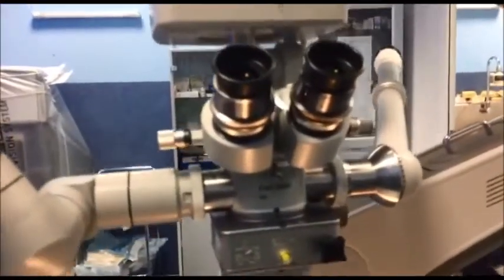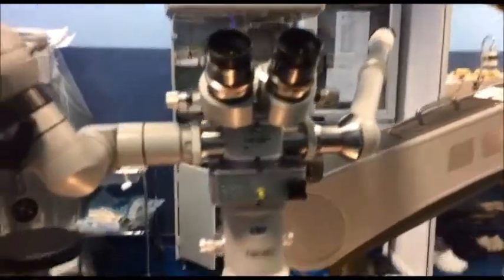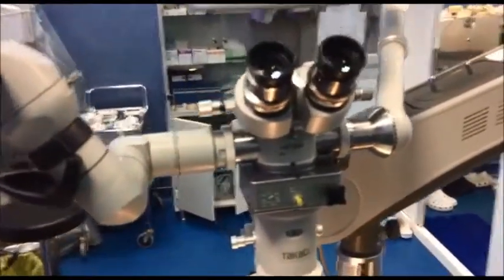Having all of this on one microscope is sometimes heavy and takes a toll on the microscope, so you can choose one or another depending on your preferences.